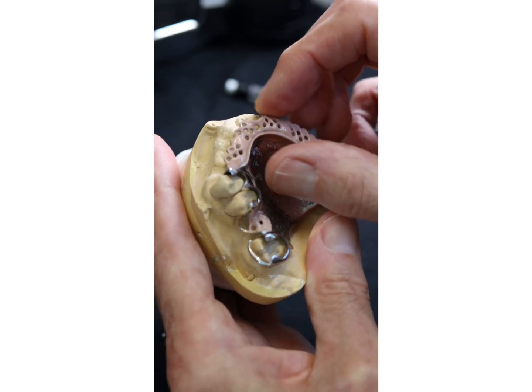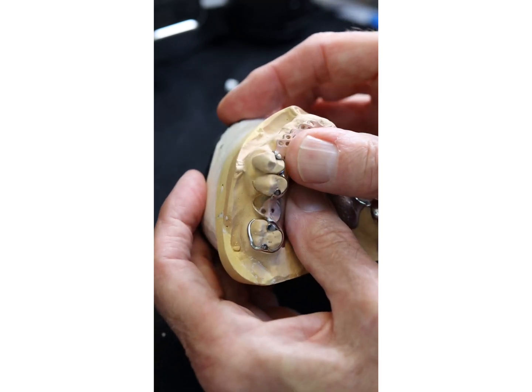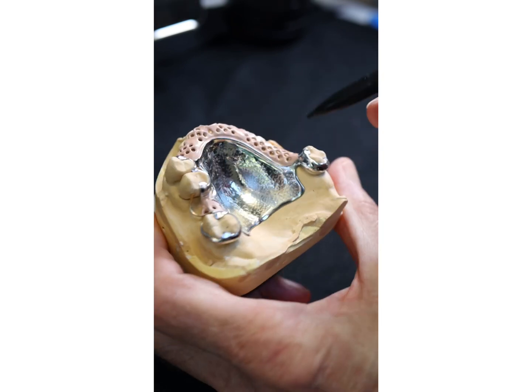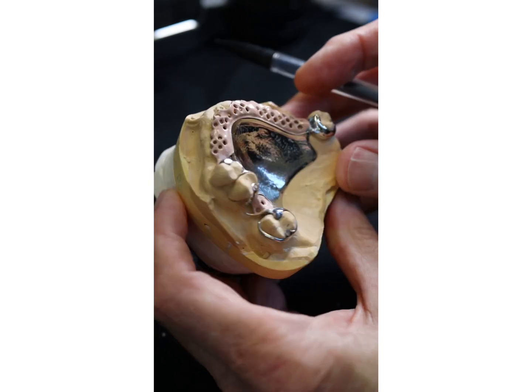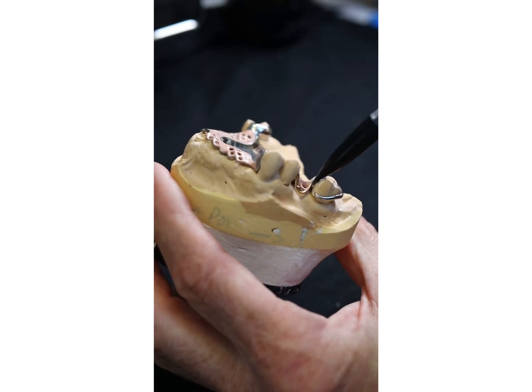So the denture base, you'll see, is pretty retentive just by clicking on. We've got frictional surface retention all around the palatal aspects of these three teeth and this tooth here. And in addition, we've got guide surface retention there and there.